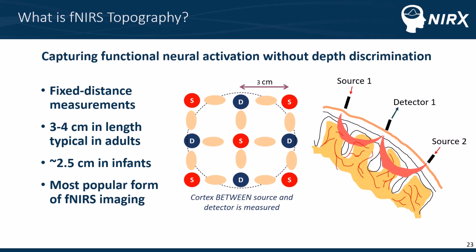It's simpler, it's easier to analyze, but there are certain limitations certainly in depth resolution and being able to do 3D reconstruction of images. So you're really limited to that one surface layer of probed tissue.